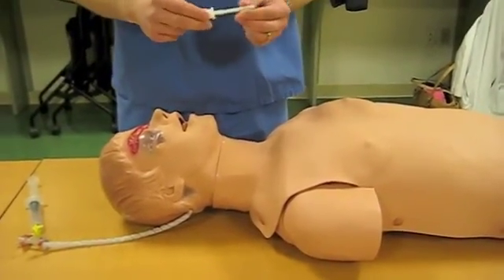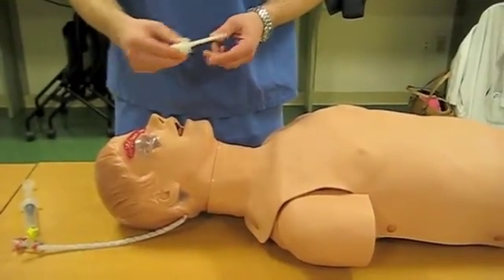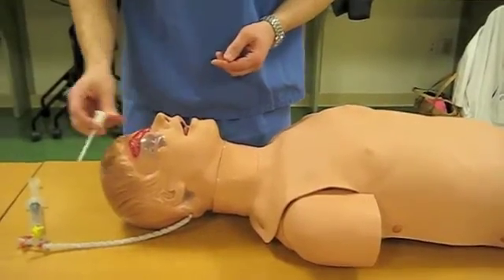This is a simulation of the Walker Cric, patent pending, used on a cricothyroidomy simulator.